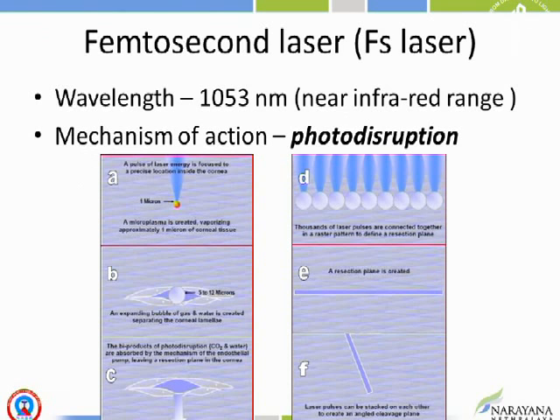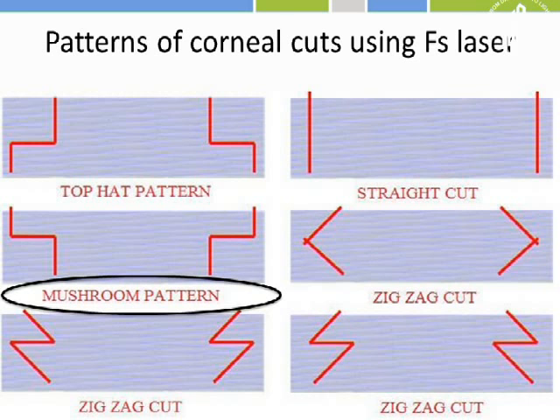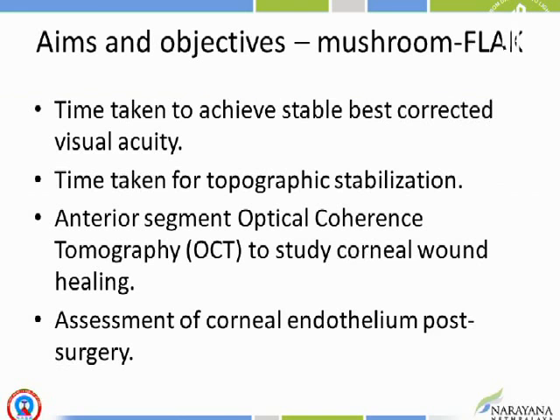Femtosecond laser has been introduced in corneal surgeries, and this has led to a paradigm shift in the way the surgeries are performed. It gives accurate cuts in various corneal planes, and we can get different patterns of the corneal cuts. In our study, I'll be discussing the mushroom pattern penetrating keratoplasty. The objectives of our study: visualization, study the corneal wound healing, and assess the corneal endothelial loss post-surgery.